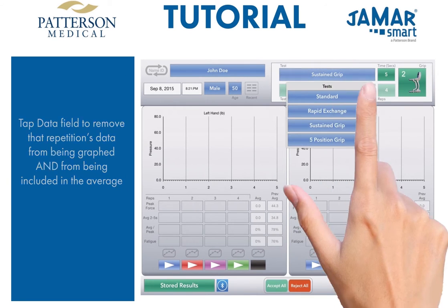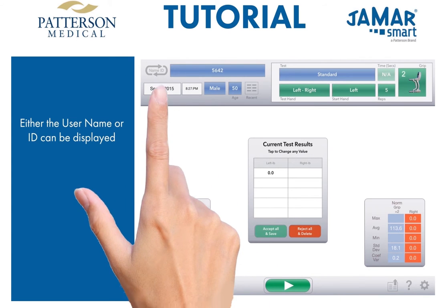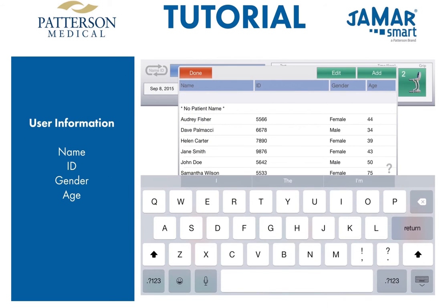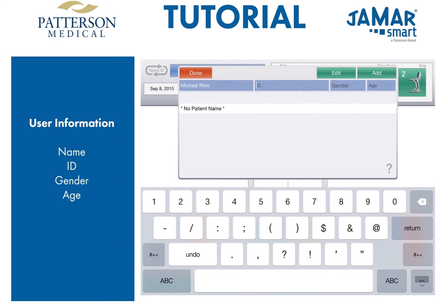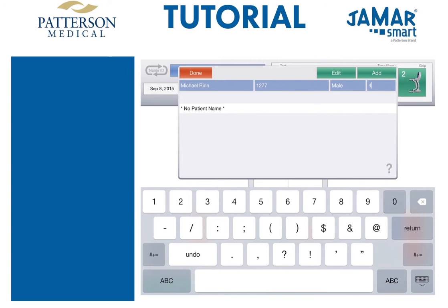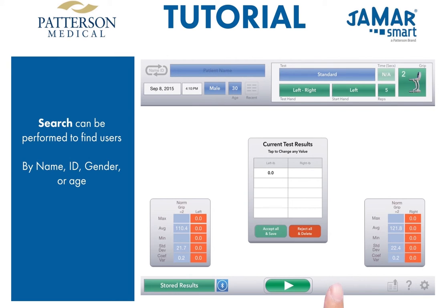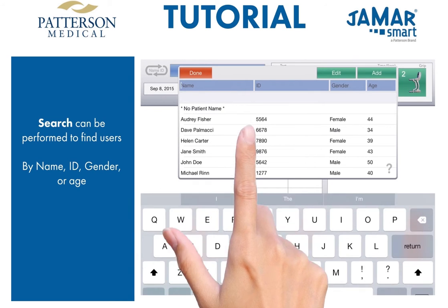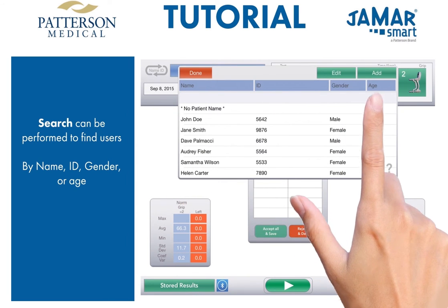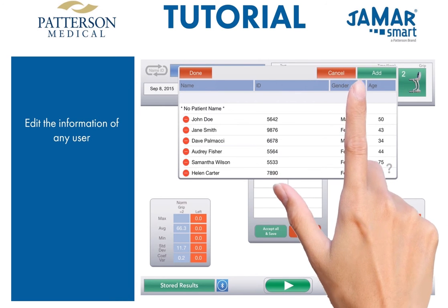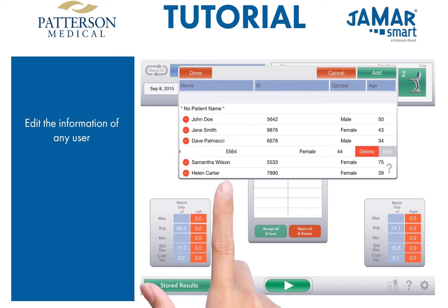User information can be added and edited from any screen, but let's go back to the standard test screen. The JMR Smart app can display either the user's name or ID with just a simple tap on the name/ID icon. To add a new name, simply tap the name field and start typing in the appropriate fields. Once done, tap 'add' and the new name will appear in the name field. If you choose not to have a name, tap the name field again and tap 'no patient name' at the top. For large numbers of users, you can search through the database by typing their name or ID, and results will appear as you type. You can also filter by gender or age. Tap 'edit' and then tap the minus in the red circle to delete or edit a user. If you make edits to the user, all previous test data will be preserved.